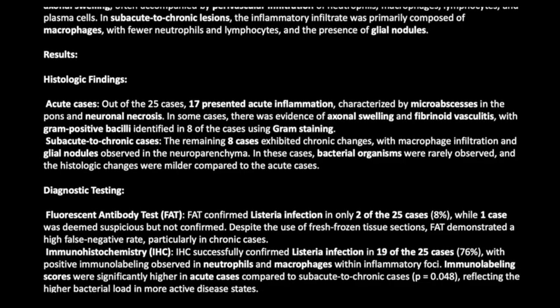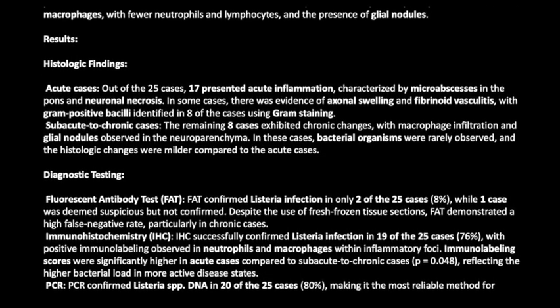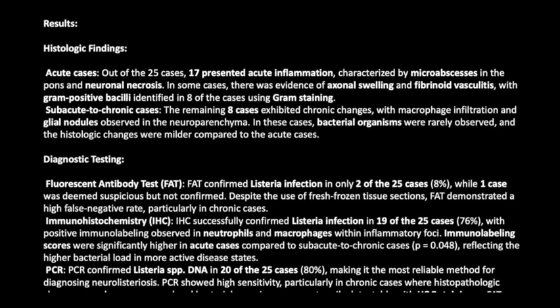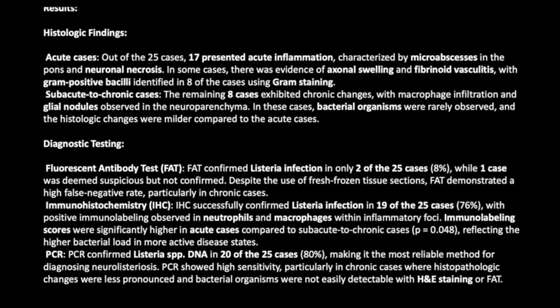Diagnostic testing. The fluorescent antibody test, FAT, confirmed Listeria infection in only 2 of the 25 cases, 8%, while 1 case was deemed suspicious but not confirmed. Despite the use of fresh frozen tissue sections, FAT demonstrated a high false negative rate, particularly in chronic cases.